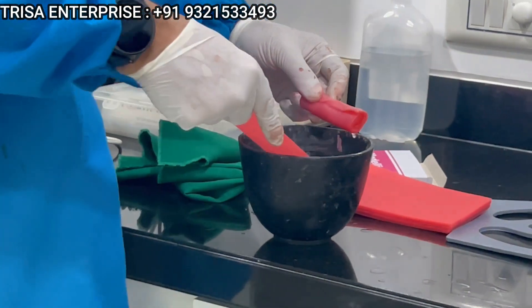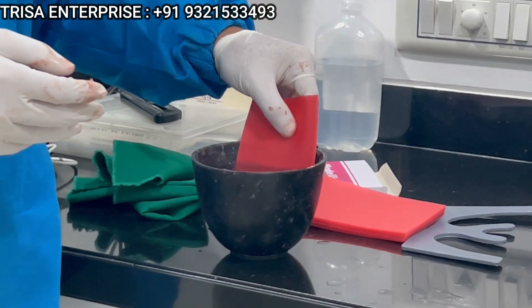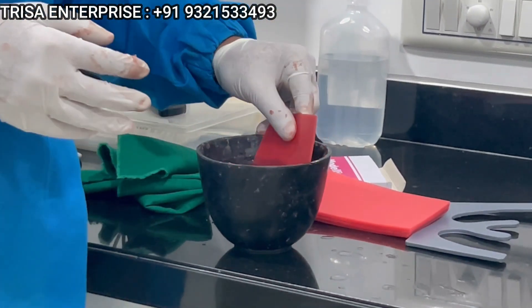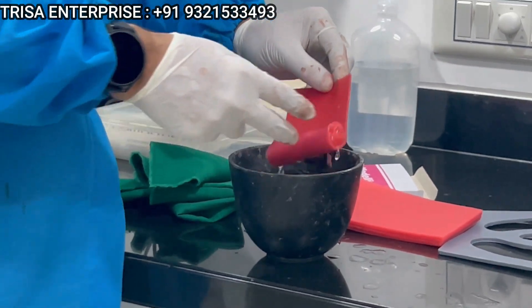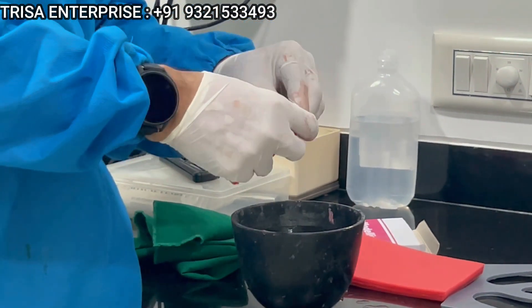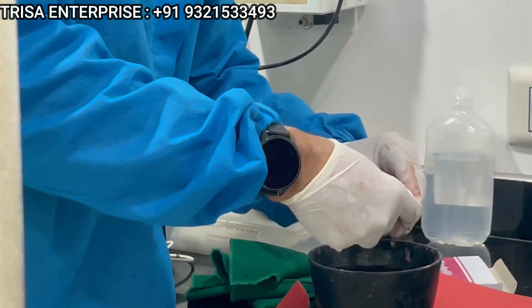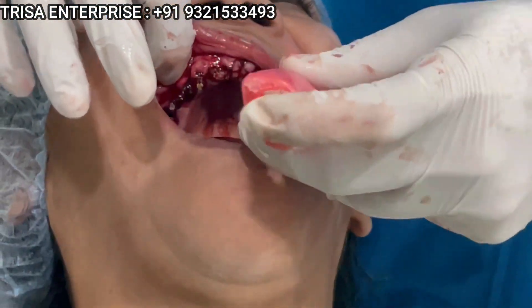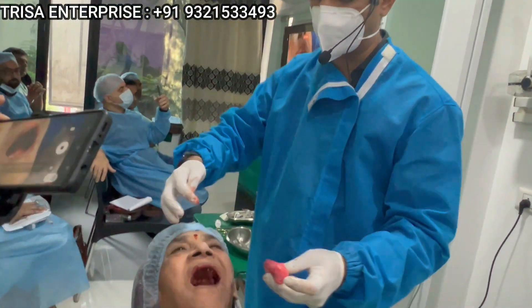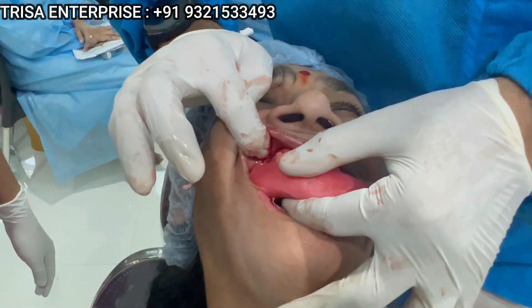I've taken one sheet of modeling wax and then over that I'm rolling another sheet of modeling wax. Now here is the trick part — once you have these two sheets, how to create a ring in the mouth. You take this open and you place it; while placing it, all your implants penetrate in the center of this. Just see how I'm doing it, and now the rim — you control it and mold it buccally and lingually.